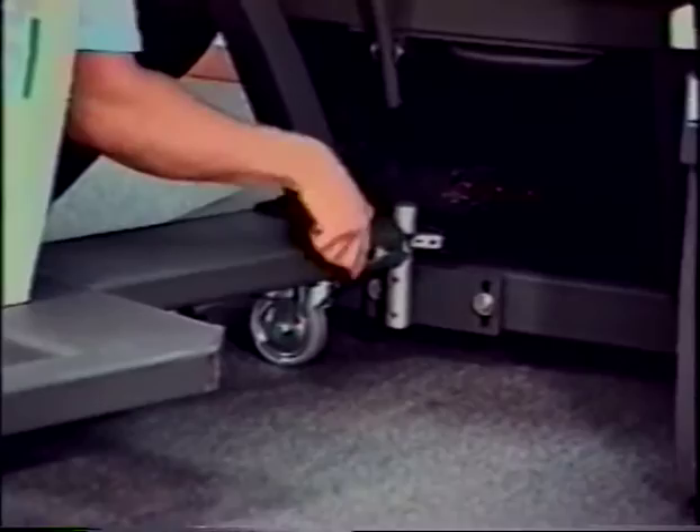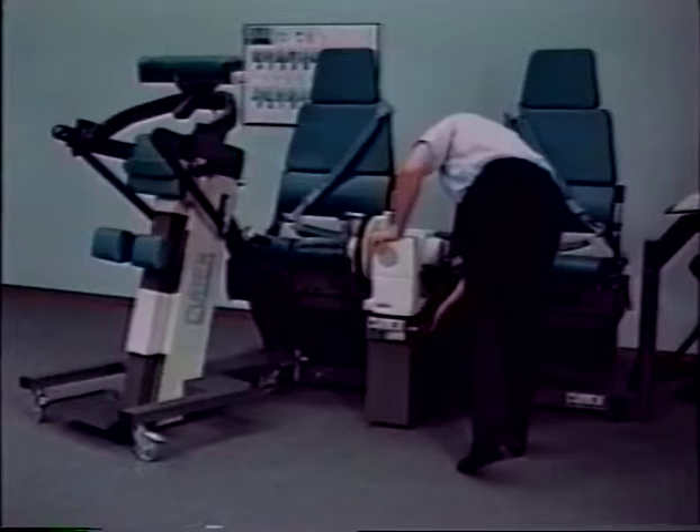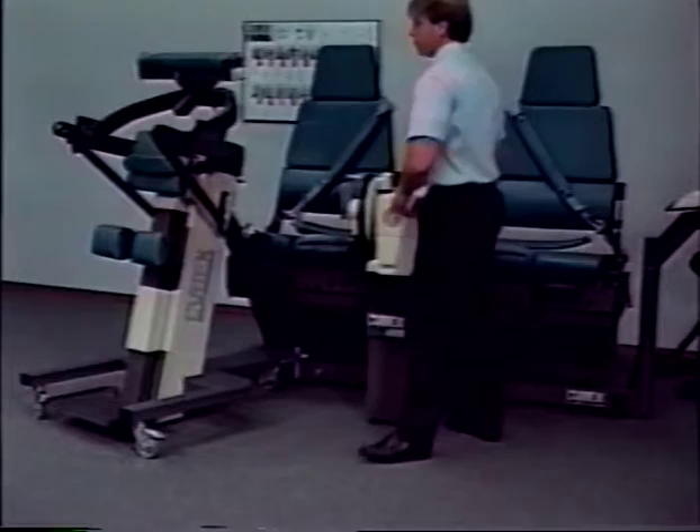Loosen the dynamometer pedestal and raise the dynamometer to 12 or higher on the dynamometer height indicator. Move the TEF modular component input arm assembly fully forward.